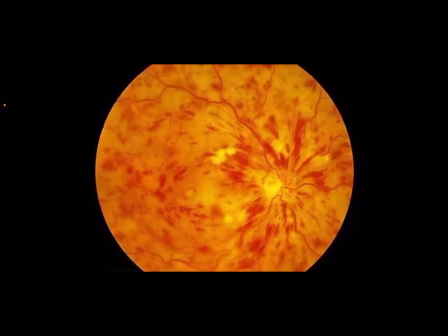You have no time for this. Don't you ever try to examine for central scotoma. This is just a matter of losing your time. Anyway, you will have, for instance, a positive Marcus Gunn pupillary sign, or you will enter with the ophthalmoscope and find a shiny optic disc, as we have just mentioned, and you can diagnose optic atrophy. So why should you waste your time? You will not be able to cover other points related to clinical judgment and history.